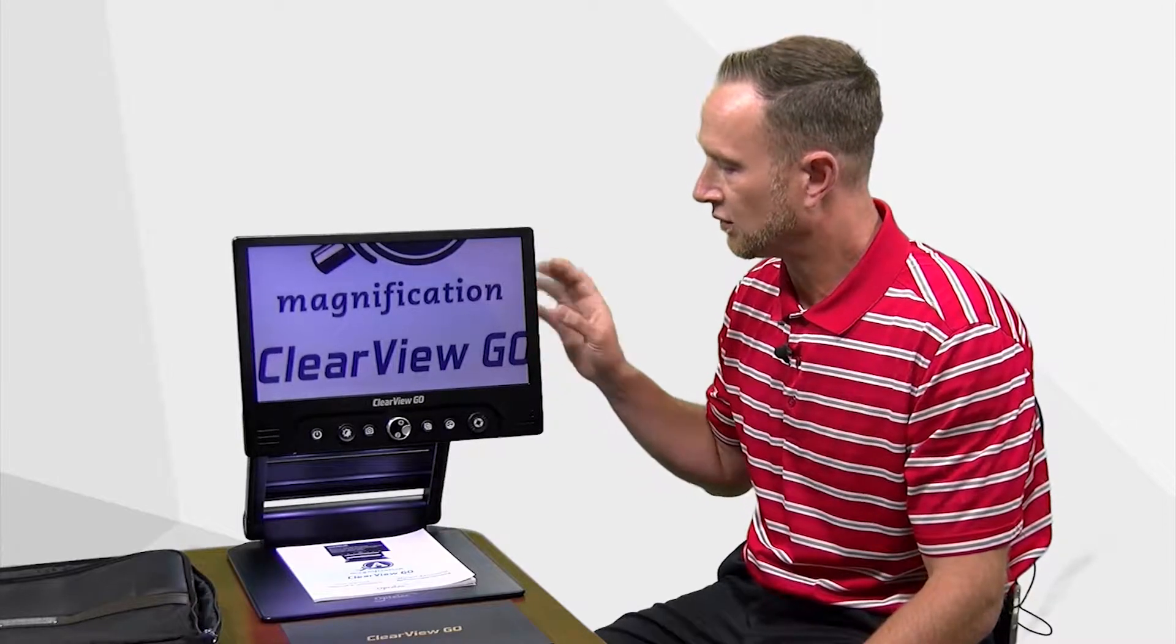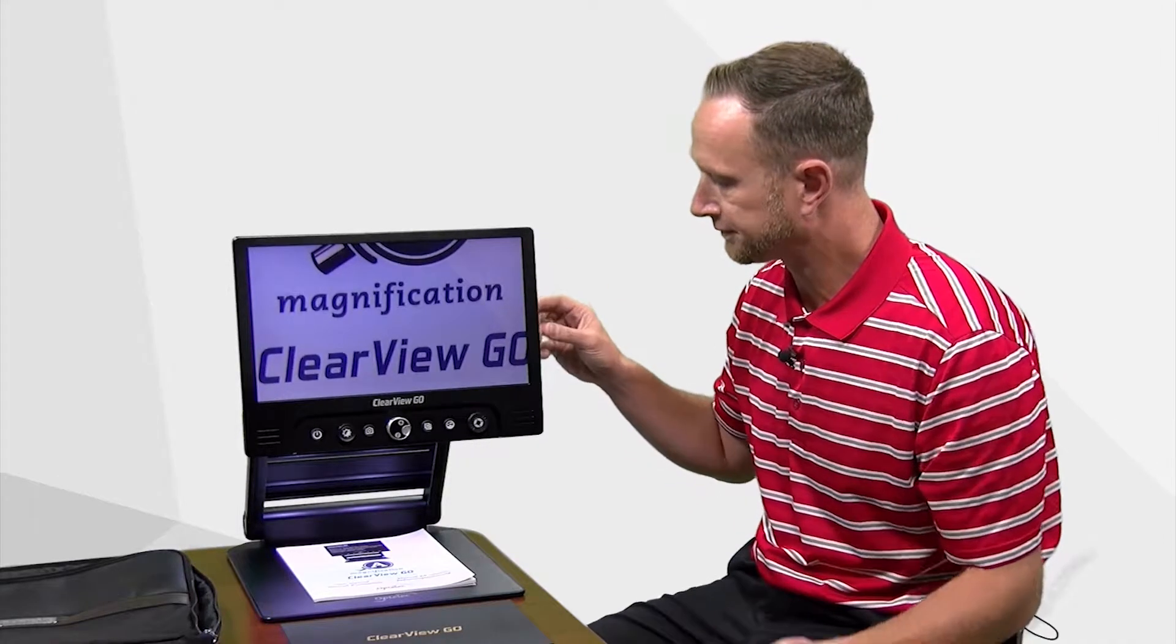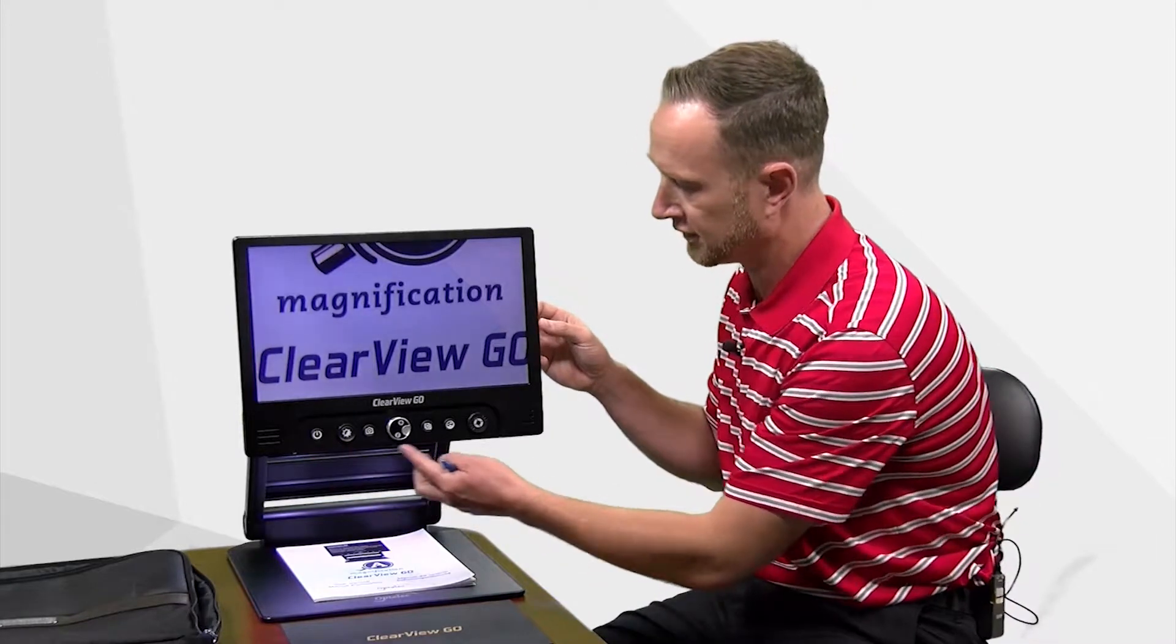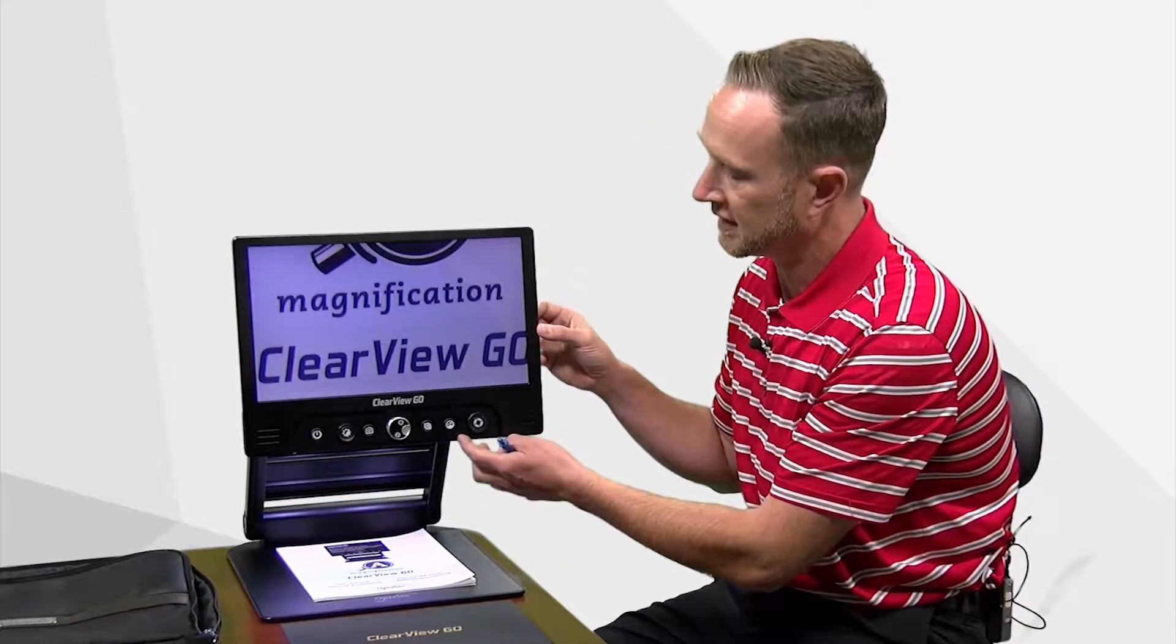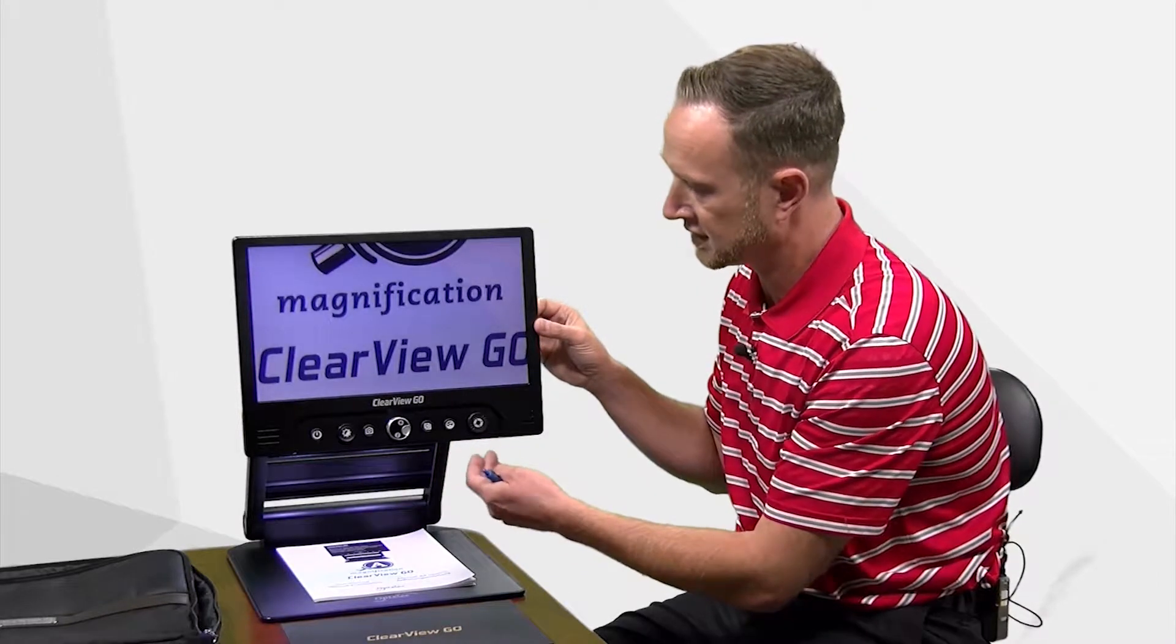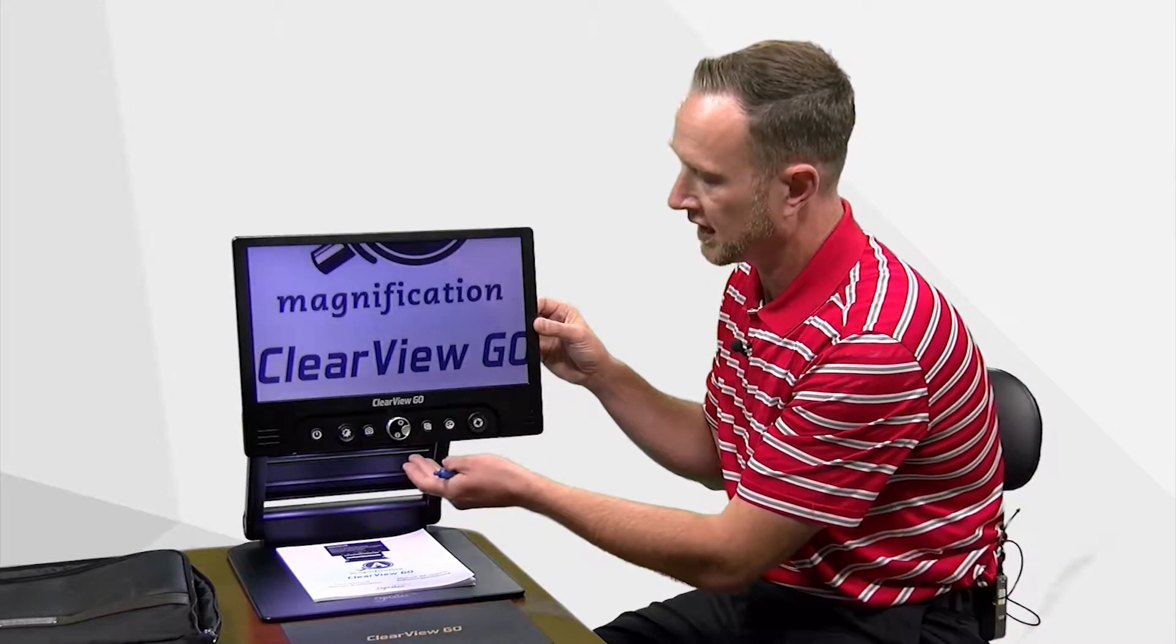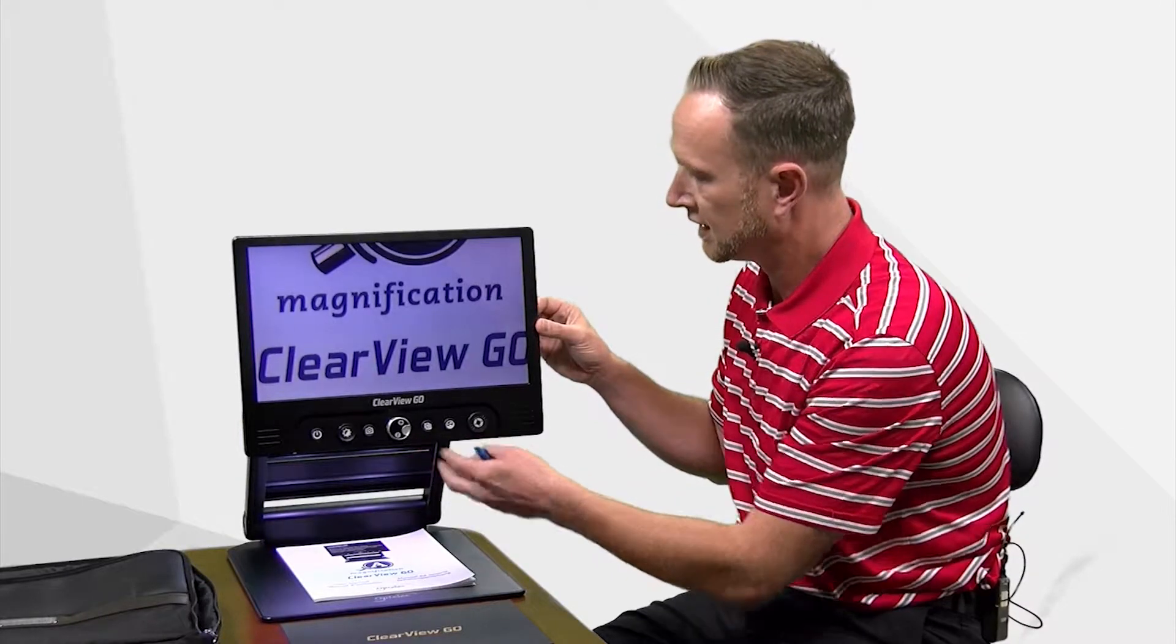So you have a wonderful image, something that can easily be taken anywhere. You have all of the different functionality of a high definition portable video magnifier in terms of changing the colors. You can do reading and writing lines, you can do windows and masks here.